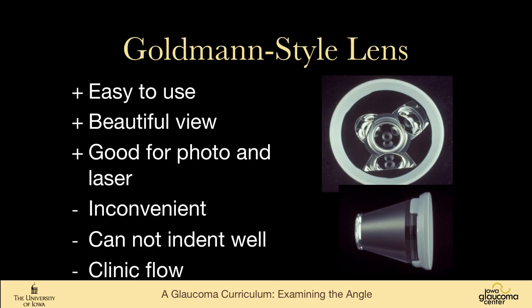And to me, they really interrupt my clinic flow, because I normally would do gonioscopy before visual fields, before the dilated exam, and any kind of imaging or photography, and the methyl cellulose from the lens really messes with all those things. So I don't use it routinely, but I use them quite often.